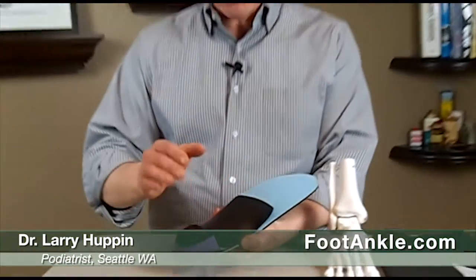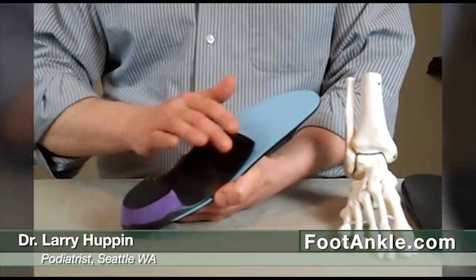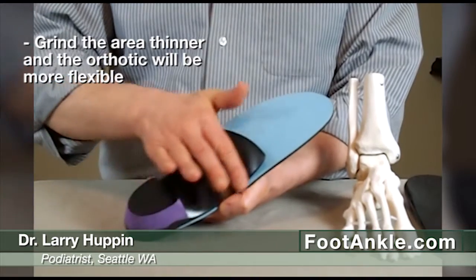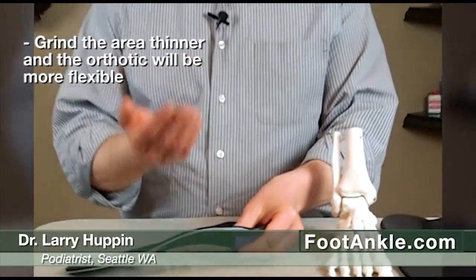Most good podiatrists who do a lot of work with orthotics will have equipment in their office to adjust them. So when I have a patient who's complaining that the arch feels a little too high when they're standing in one place, if I want to adjust that orthotic, I just grind it a little thinner in this area here. That makes the orthotic more flexible, so it's more springy and doesn't put quite as much force onto the arch of the foot.